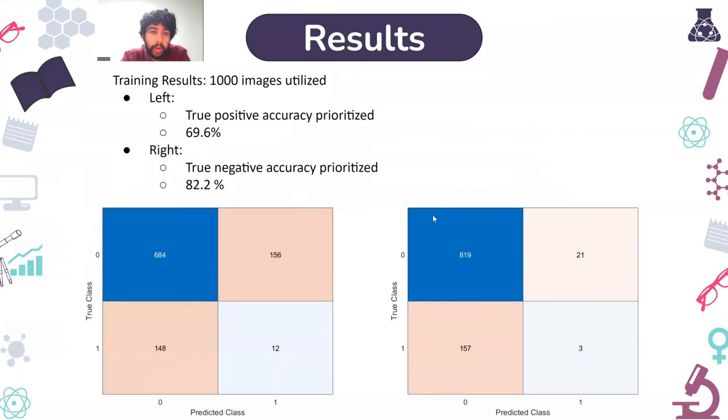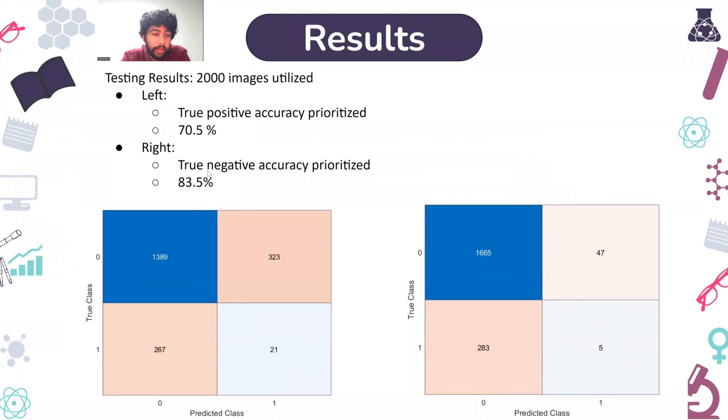These are our results. This is our accuracy for the training, and these are our accuracies for the testing. They're lower than we hoped. This is likely because we detect specific features that belong to certain types of hemorrhage, so we can't identify all types of hemorrhages.